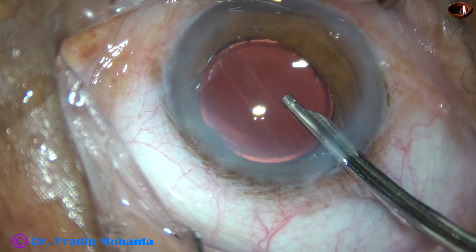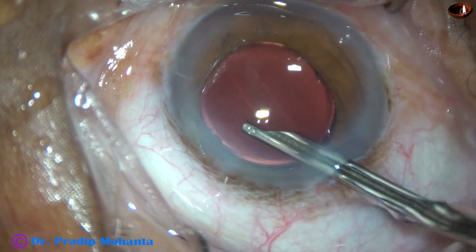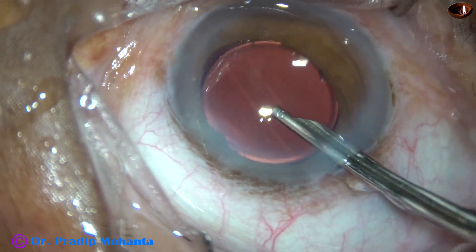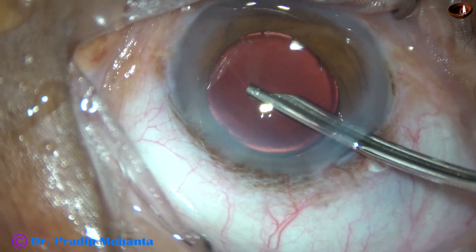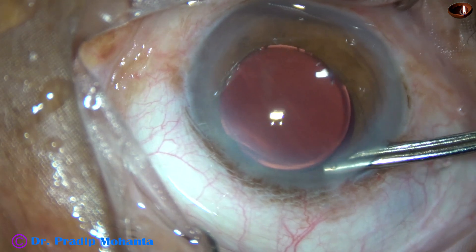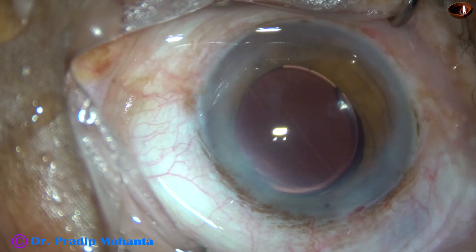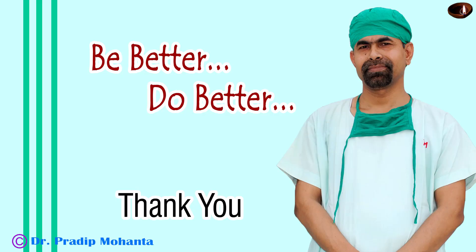Once the side ports are closed, this is the final lavage of the anterior chamber. Watch how I form the anterior chamber — the main wound doesn't need any hydration. I check the wounds; there is no leakage from any side. Thank you very much for your attention. Hope this video will help you in developing your surgical skills.